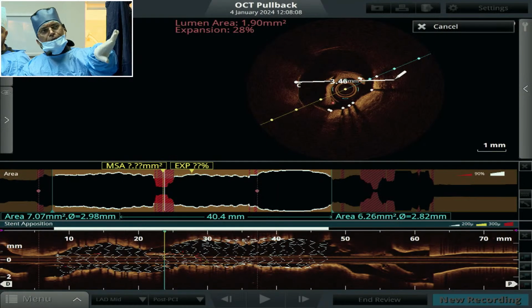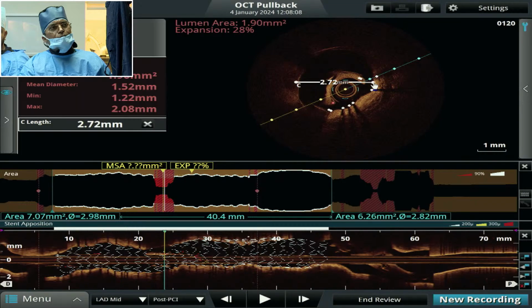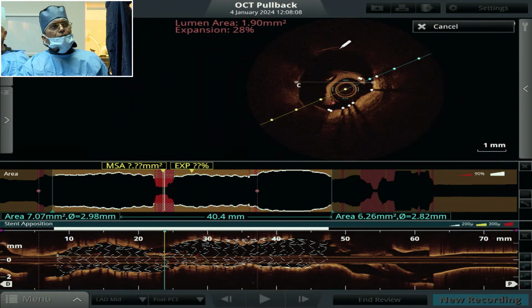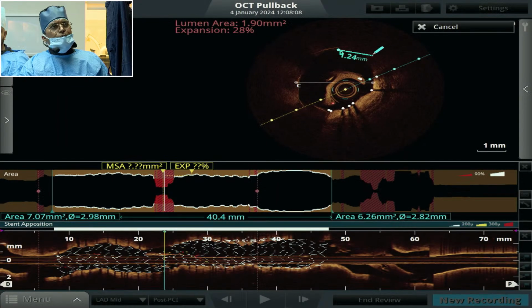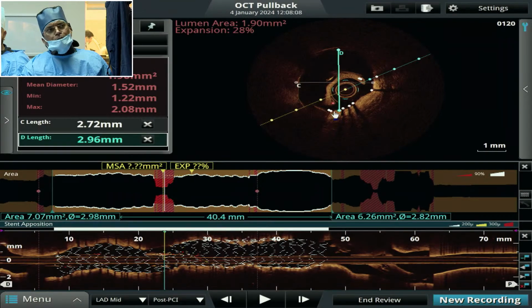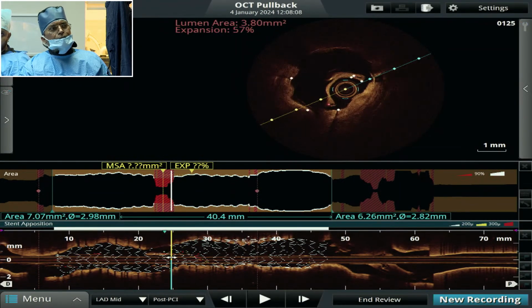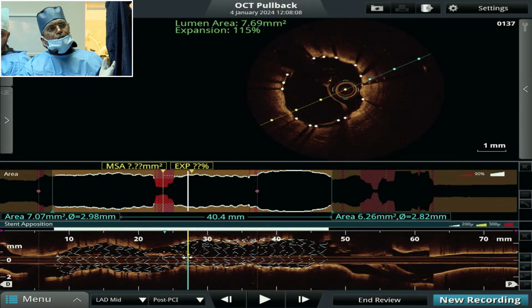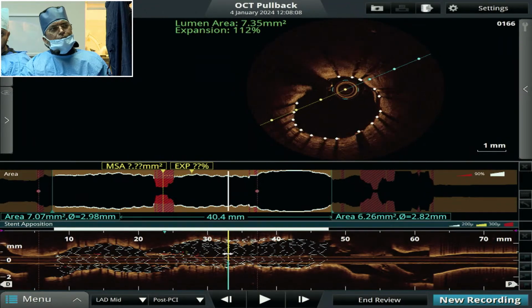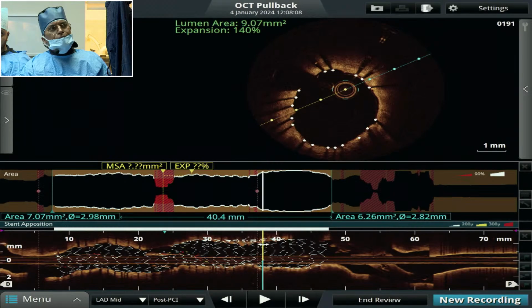No, inside the stent only. Go to the stent border only. Yeah. Now you got 2.72 vertically. Come. Not 2, almost we got a 2.8. Okay. Go to the next. Move. Here also we got a very good area. Next move. 7.3. Area is fine. That is the diagonal.